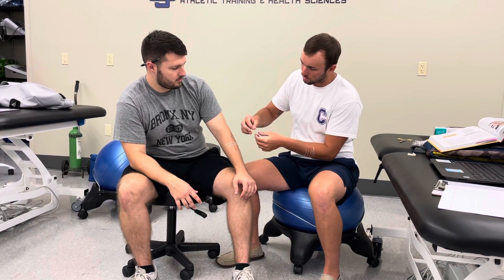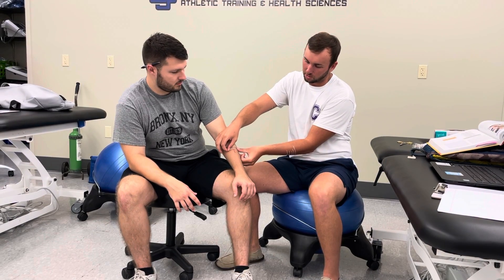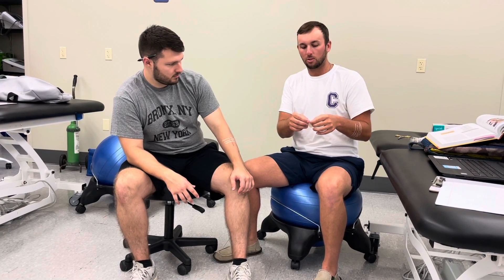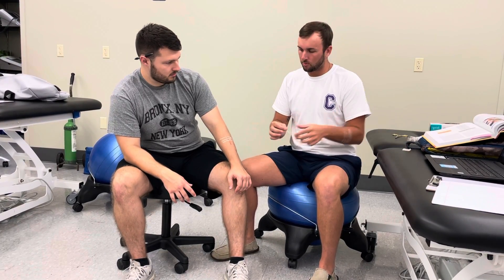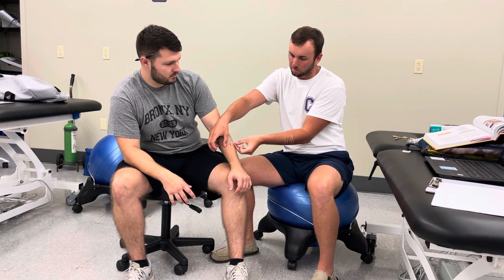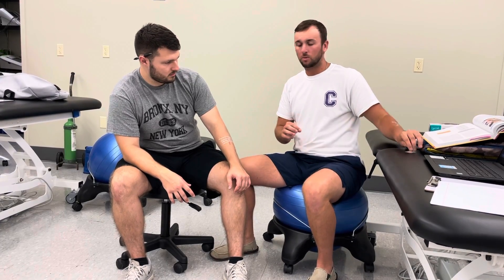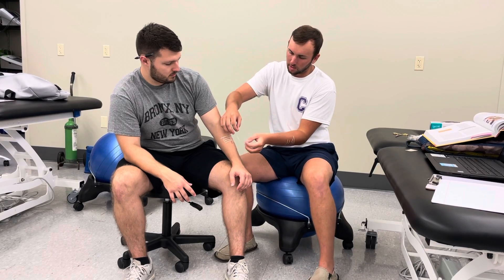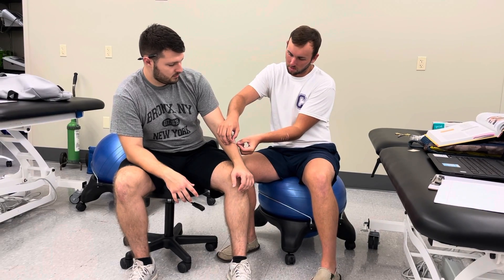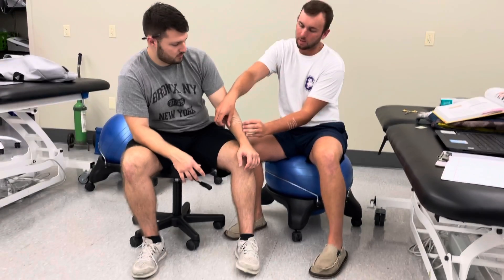Depending on the wound, it will depend on how many Steri-Strips you'll need, or if that is the right route to go. It's important to alternate for this sort of thing — that way the closure is equal. And that's how it's done.